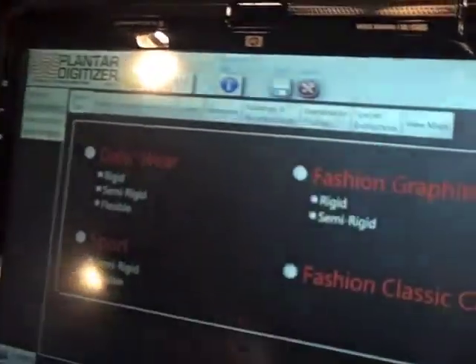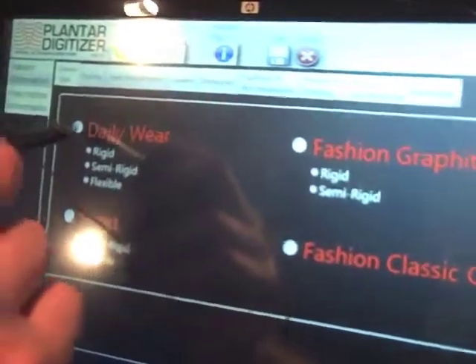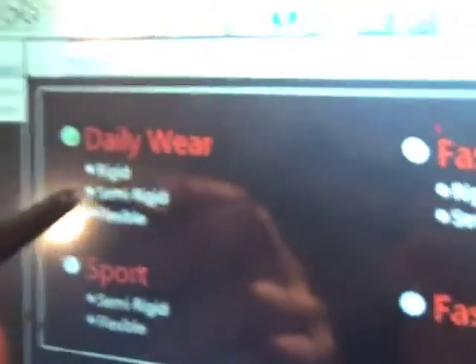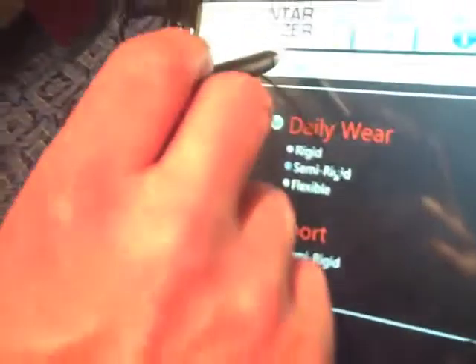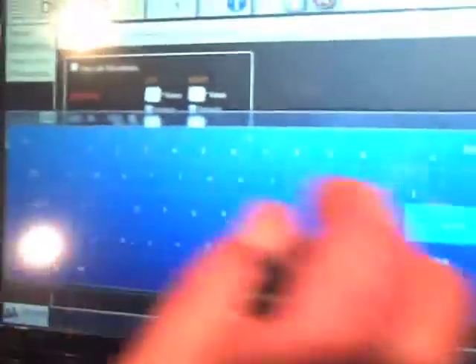We can select the device type — we're going to make a daily wear orthotic, semi-rigid. I'm going to put my posting instructions on here: four degrees in the rear foot. We can select forefoot posting, rear foot posting, intrinsic, extrinsic — whatever the doctor would normally select for a plaster cast, we can do with this system.